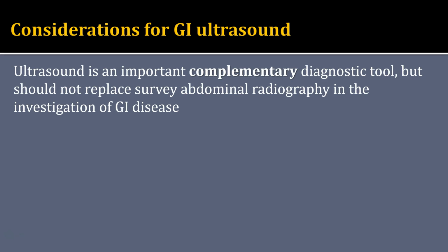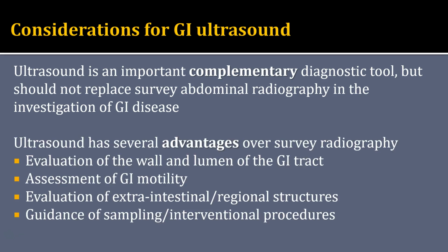Ultrasound is an important complementary diagnostic tool, but it should not replace survey abdominal radiography in the investigation of GI disease. And in some instances, other imaging options may be a better choice than ultrasound.